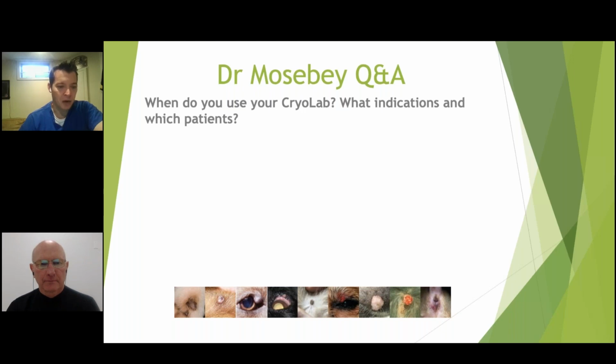But generally no. I'm finding sometimes with some patients who might be more sensitive, or a lesion that's in a more sensitive location, those I've started to use local more. I'd rather have it done right the first time than mess around, try and treat it, and have to come back and do it again.